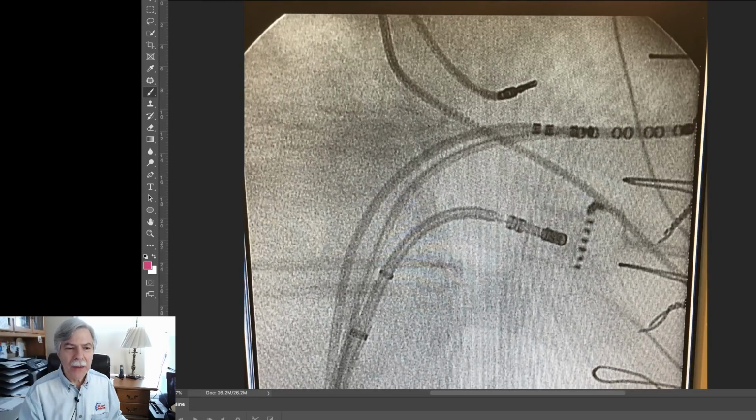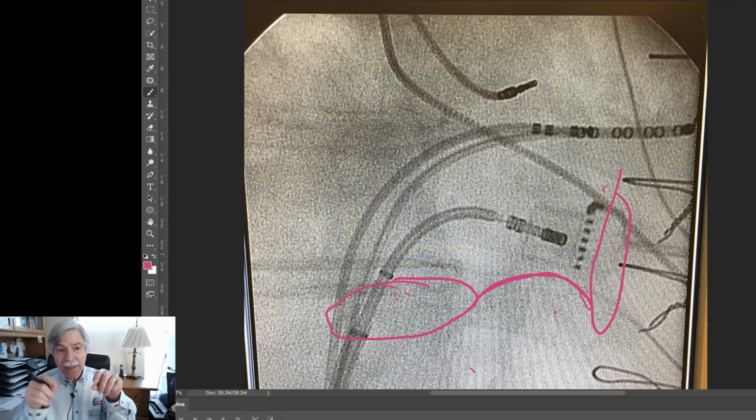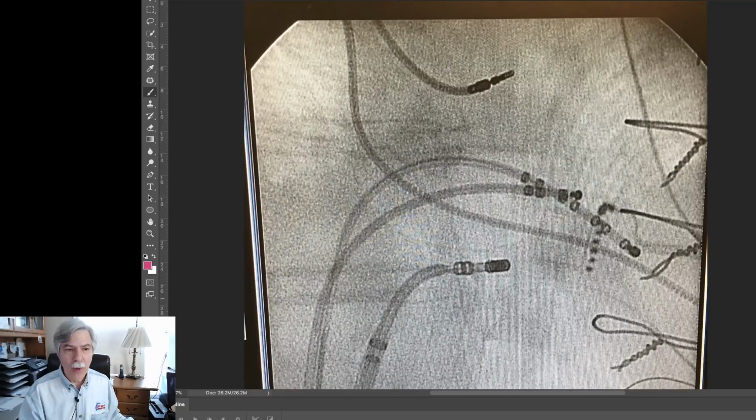Okay? And we follow the landscape. So if the inferior vena cava is here, and the tricuspid is here, that isthmus of tissue is going to be this way. When you're in the lab, you know that you're contacting it, because the catheter actually can measure the contact force, how much pressure you're putting on. You have 5, 10, 15 grams of force, so you know that you're actually in contact with it. And then we pull back again, and we're almost at the margin of the inferior vena cava here.